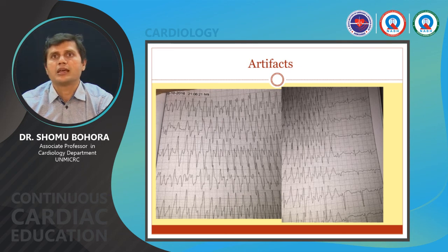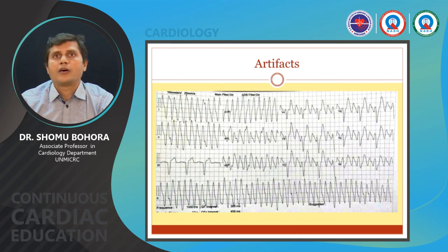What you have to see is certain leads may show that there may be QRS complexes, as in this, or in a 12 lead you can see that most of them have a broad complex rhythm, but one lead shows a regular rhythm, and therefore these should be artifacts.